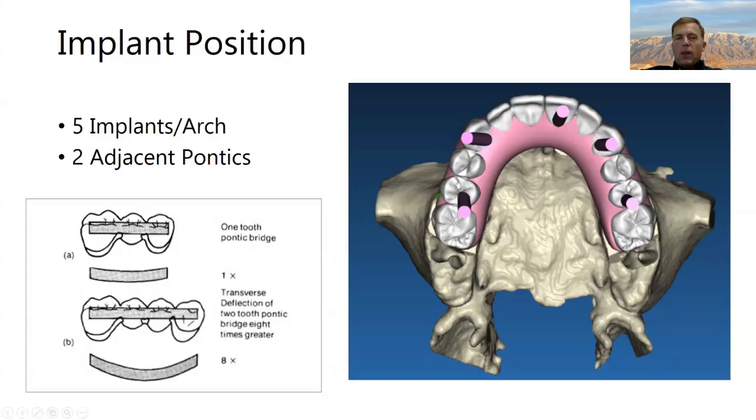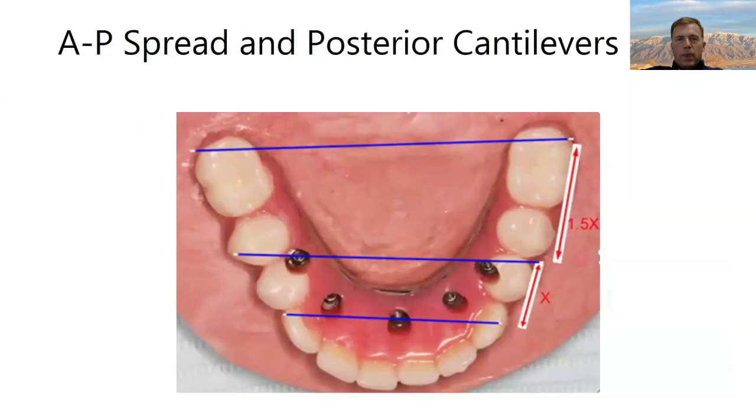The other thing we want to think about is how much load there is on different teeth. As you guys know, cuspids experience 2 times the occlusal load of any other anterior teeth. First molars, 3 times any other teeth. So if we change this case and did 3, 6, we'll say 9, 11, and 14, that would give us the best case scenario. And because we're going to talk about cantilevers in just a second.